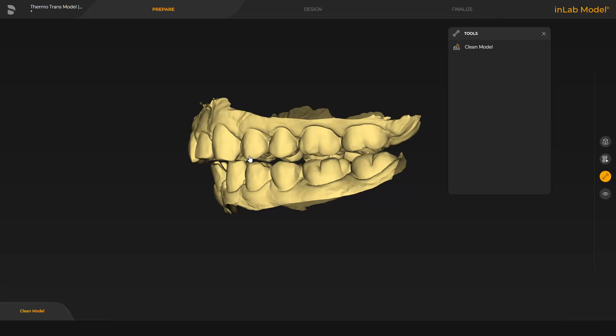The model app contains three phases. We start in the Prepare phase with the Clean model step. First, we open the Select construction type option from the page palette. For our case, we switch to the Thermoforming option.